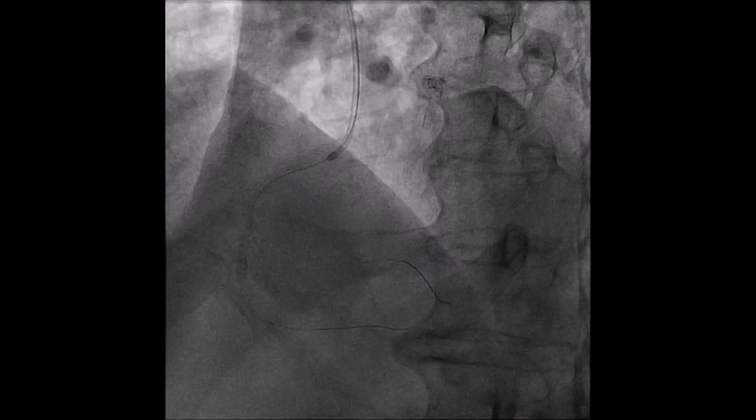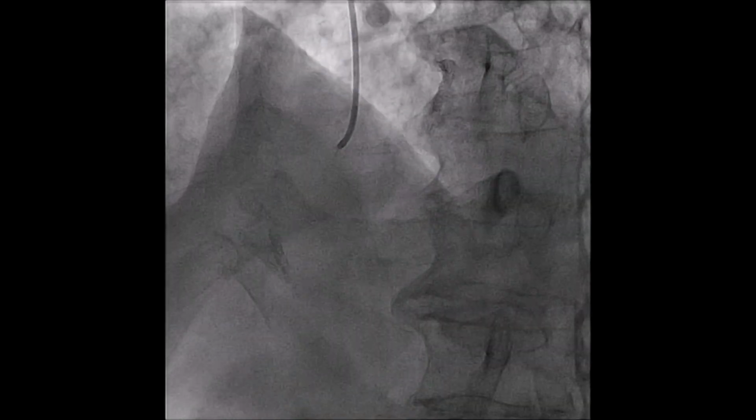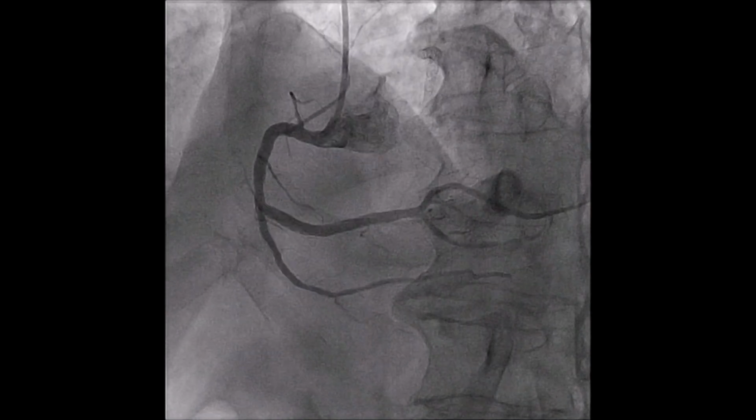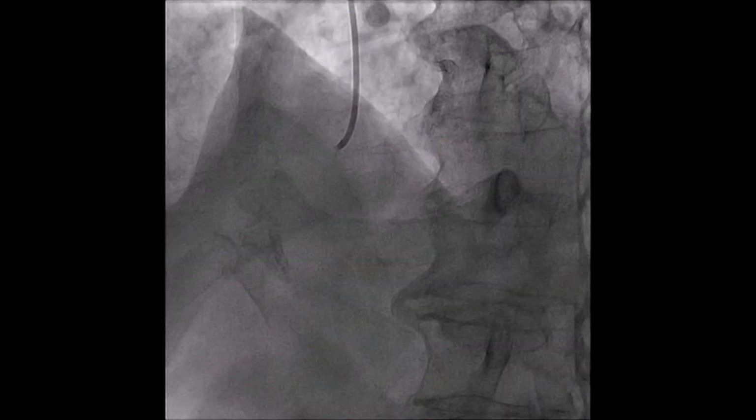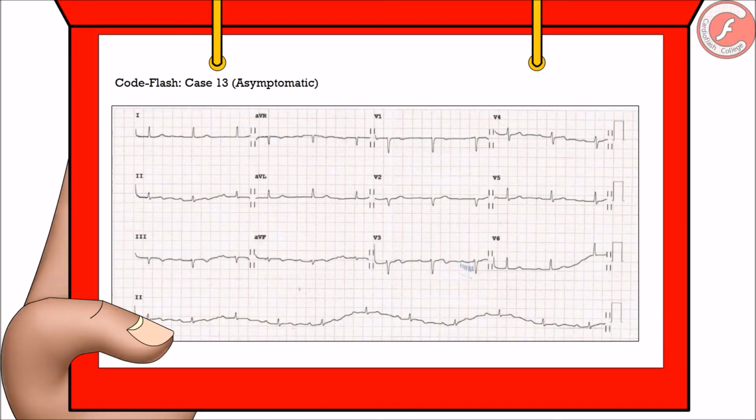As you can see, we have recovered the blood flow of the artery after implanting the stent, obtaining a good angiographic outcome and without procedural complications. In this way, with the artery open, the ST alterations are progressively improving and pain disappears, this emergency being resolved, and with it, our chapter.